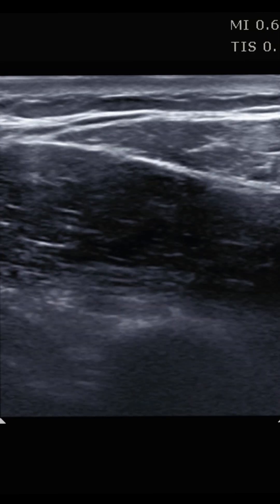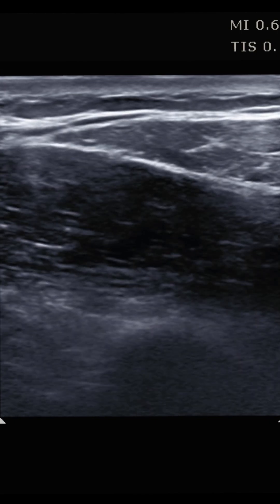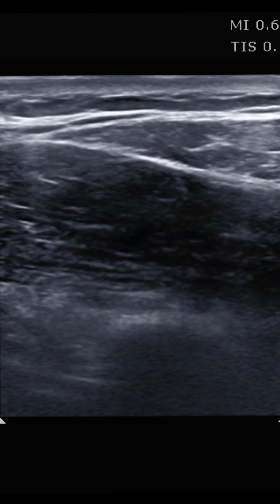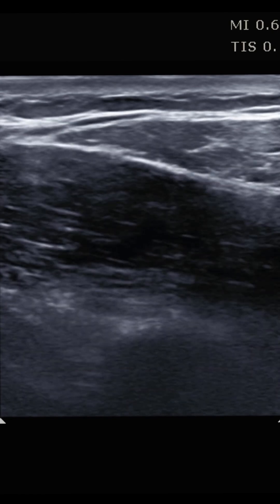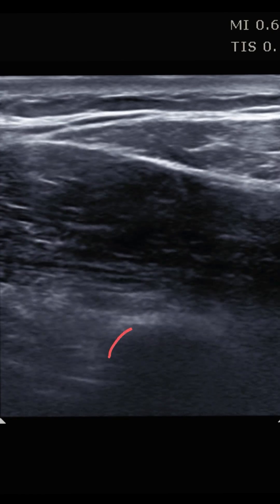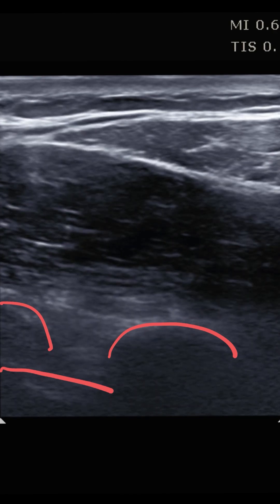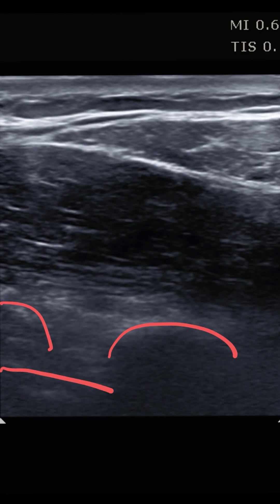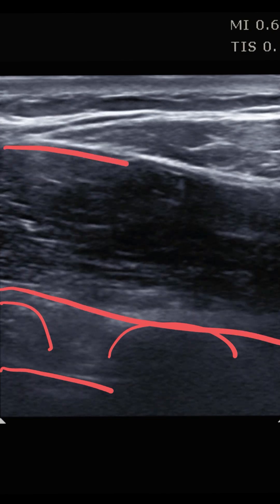This is a view of the normal anatomy we're going to look at. What we're essentially looking for is the plane between the latissimus dorsi muscle and the serratus anterior muscle. The first key landmark is the rib — we can see a rib here and a rib here, with that pleural line just underneath. The muscle immediately superficial to these ribs is the serratus anterior muscle.